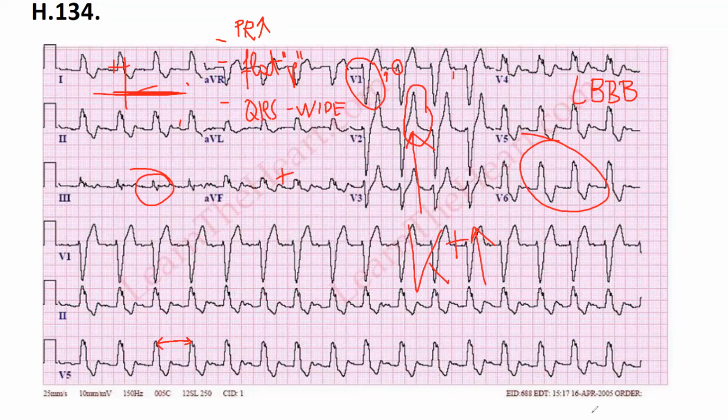Of course, you are not going to measure the potassium level based on the ECG, because you can send the blood sample to the lab, but it does have signs on the ECG. What does hyperkalemia do?